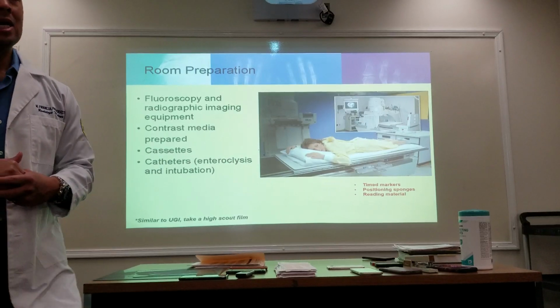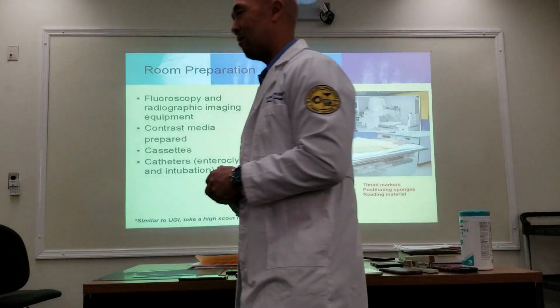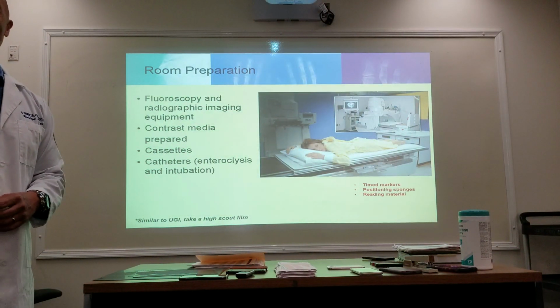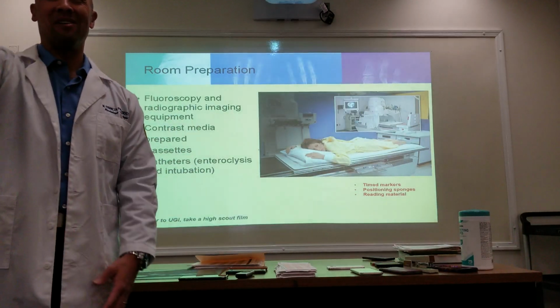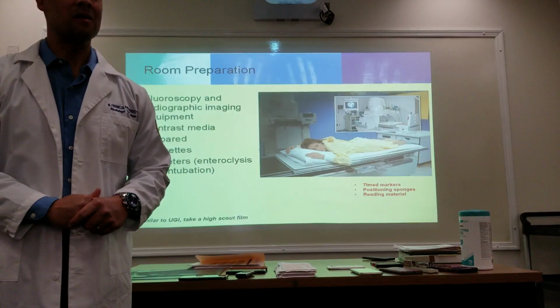Okay? Now what if the patient came in for an esophagram, an upper GI, and a small bowel? It's still 2. It's a chest x-ray, it's an abdomen. So the scout for a small bowel is still high? It's still going to be high. Okay. Yep.